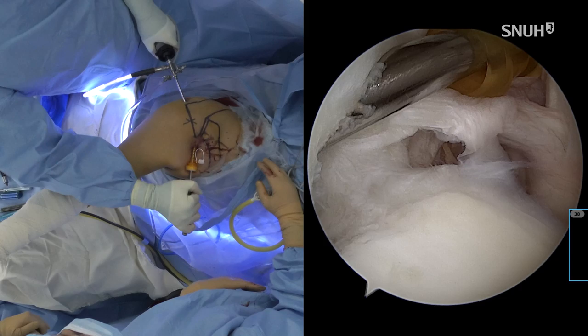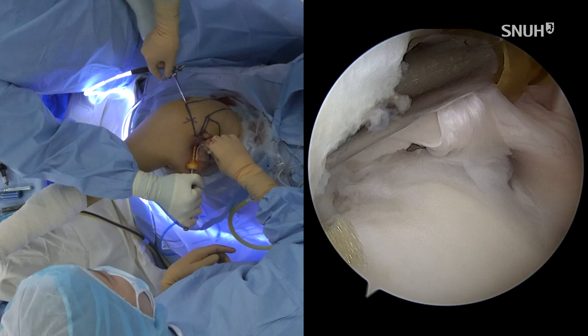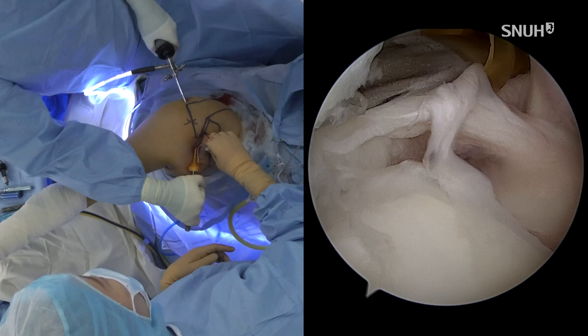Suction on. So you can open the outflow to let the cyst fluid flow out through the anterior cannula.